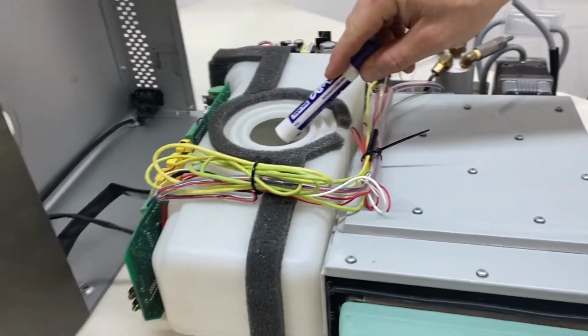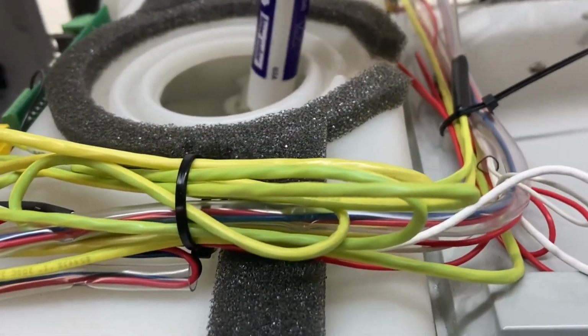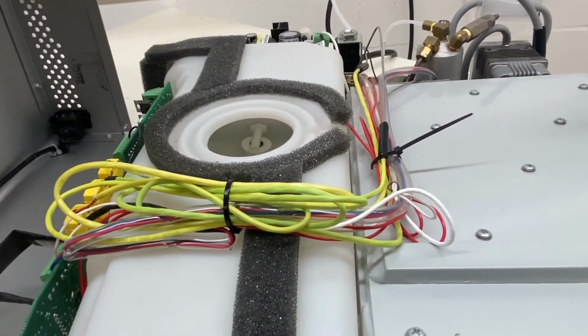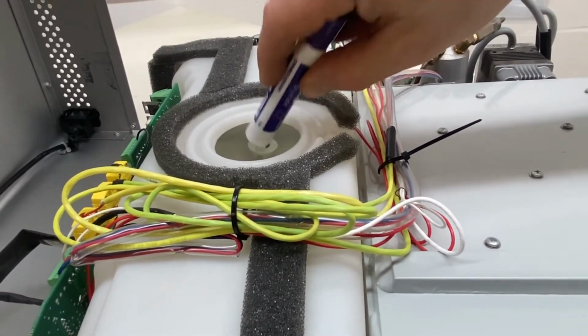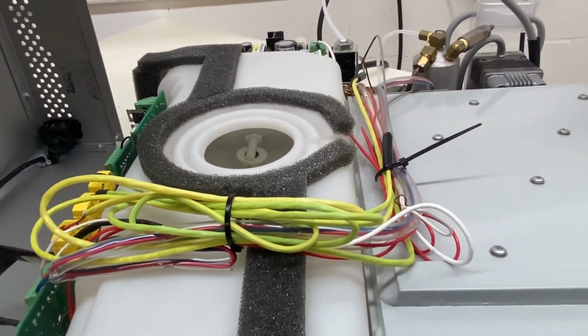So we're going to go in here, you're going to take your cap off, you're going to take your filter out, then you're going to look in here and you're going to make sure it's full of water. If it's not full of water, if it's empty and you're getting this error, take a ruler or a long object and tap it on that object right there. That's the float. If you see it way down in there, tap it on that. That may allow the float to drop.